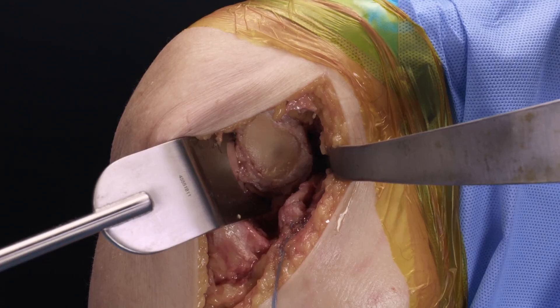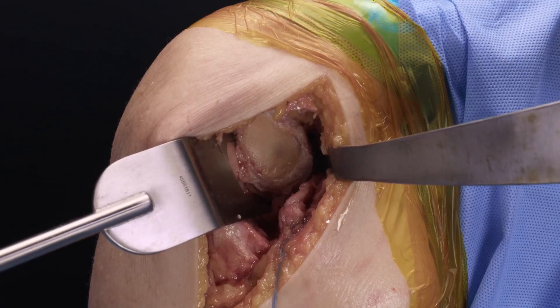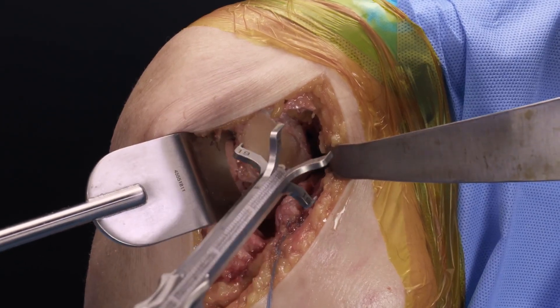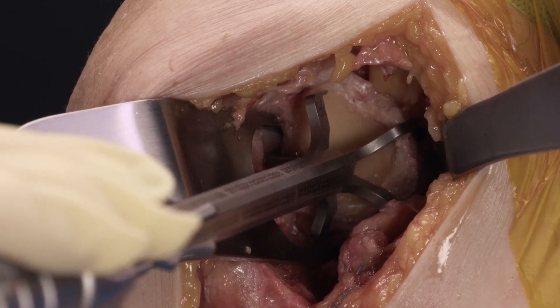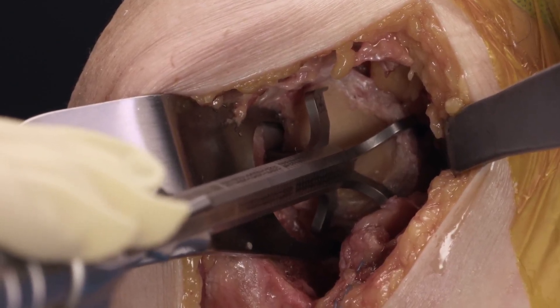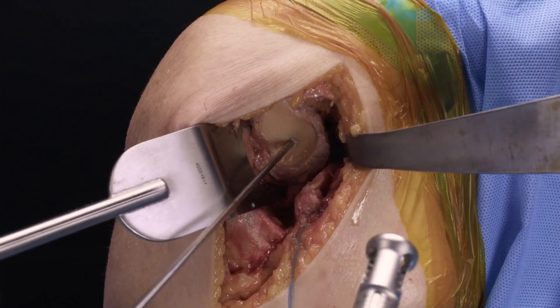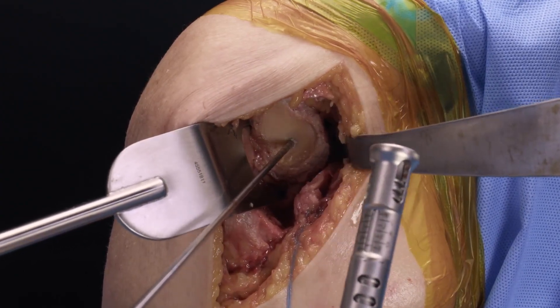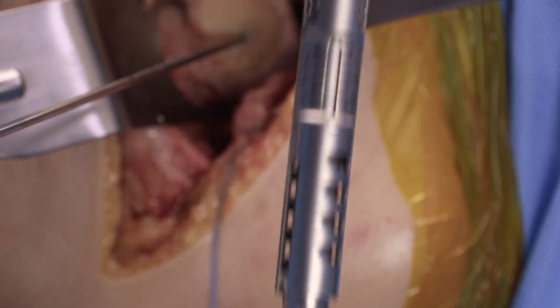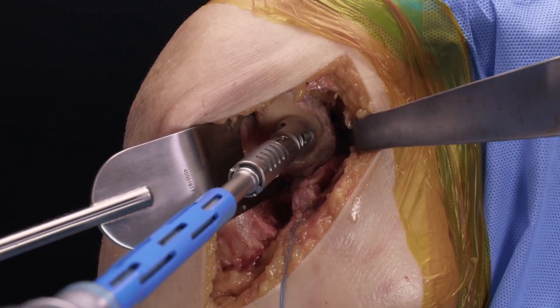I will now demonstrate in a cadaver the use of the VIP glenoid reamer. We've done our standard exposure and capsule releases and have an excellent view of the glenoid. I will now place my guide pin for my standard MGS base plate using the VIP targeter as is typical. Our depth for the VIP pilot reamer is set at C per our VIP plan, and here I'm using the VIP pilot reamer to create our pilot ream hole.